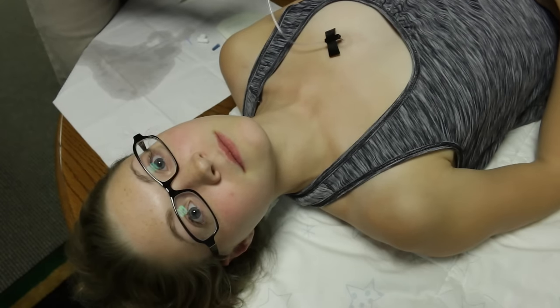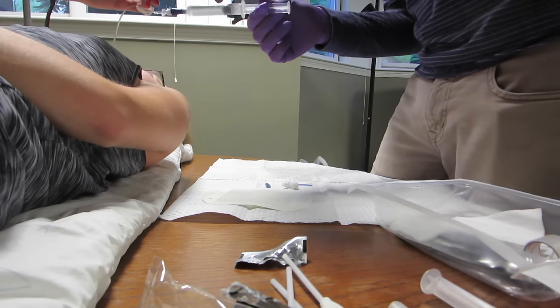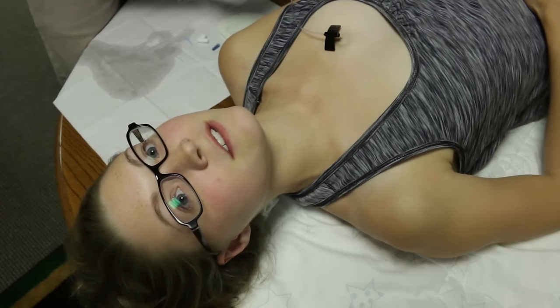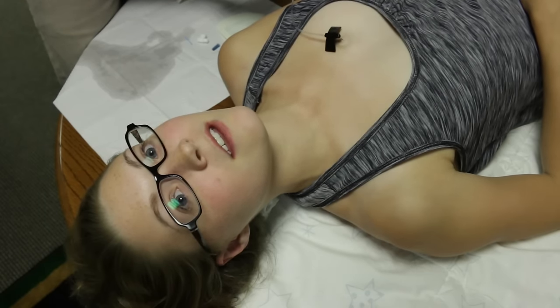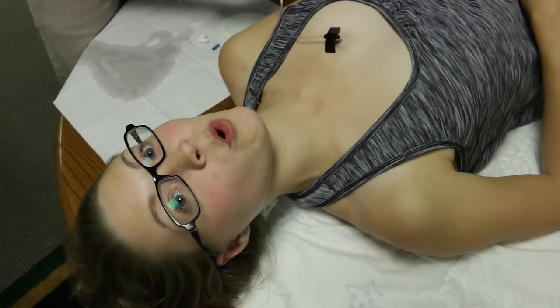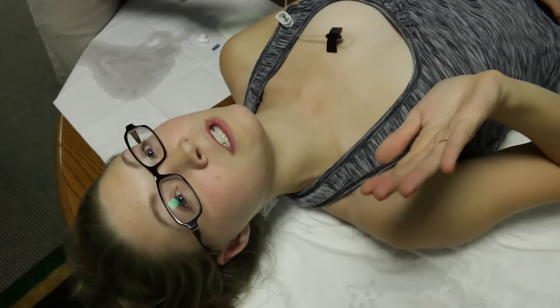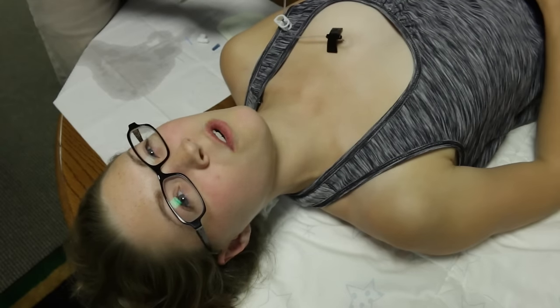It's unclamped and flushed. We're going to do a quick drawback just to make sure we get blood return — and there it is. If you're in the right place in the port it should be easy to flush and you should get blood return. If you don't get blood return, you may be in the wrong spot or there may be a port issue — not necessarily a huge deal, but definitely call somebody. If you can't flush at all, you're in the wrong spot or have an issue that needs to be figured out.